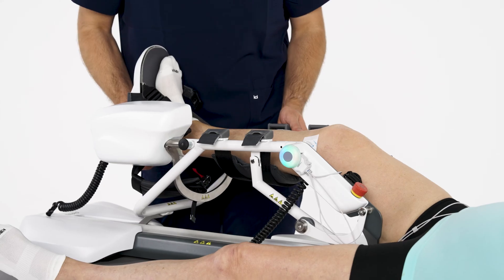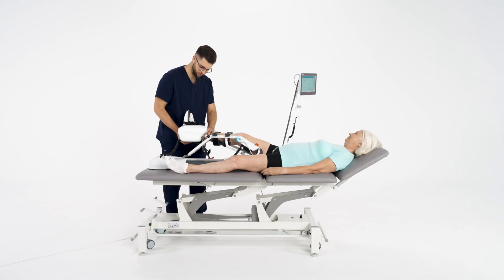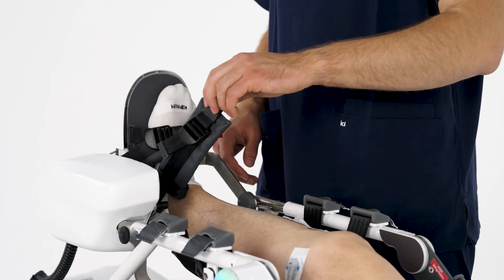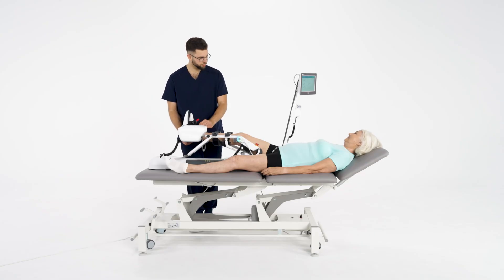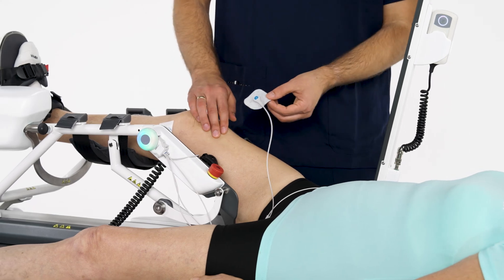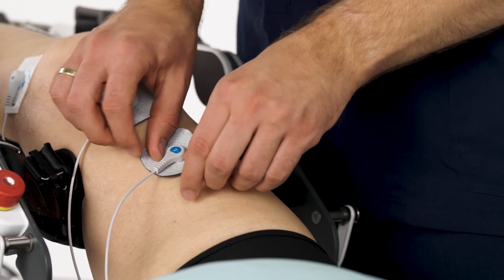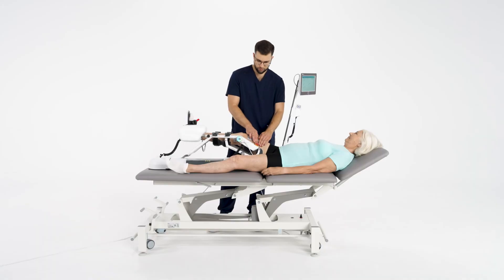Sidralec is a lower limb robotic device for neurological and orthopedic patients. Patients can regain the range of motion, muscle activity, or strength thanks to robotic movement, electro-stimulation, and electromyography provided at the same time.